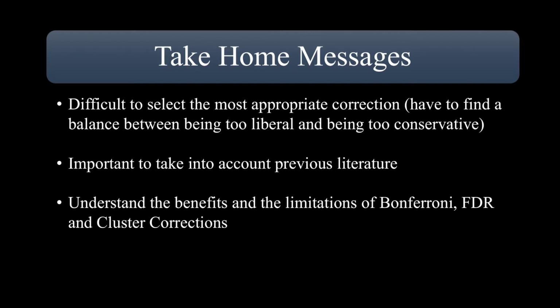Choosing the correct correction method and criteria can be quite tricky. Mathematical modeling has shown that the probability of false positives increases with the flexibility of the method of analysis and selective reporting of results from favorable analyses. It's important to take existing literature into account when considering what corrections to use. In the case of our data, we know that based on previous studies, in the faces condition, there should be activation in the fusiform face area, the FFA, the occipital face area, the OFA, the superior temporal sulcus, the STS, and the amygdala. So methods that preserve the activation in these areas are more suitable.